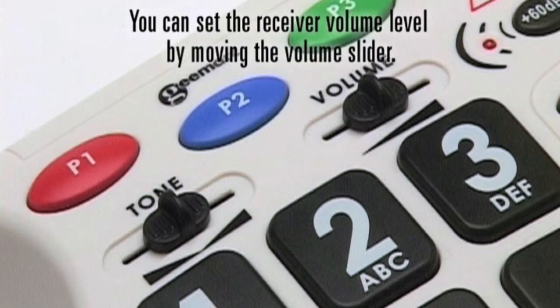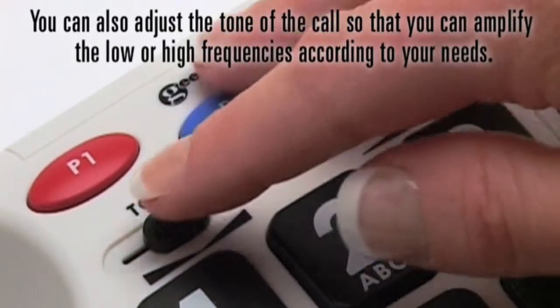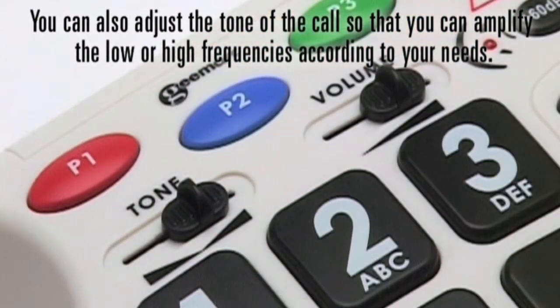You can set the receiver volume level by moving the volume slider. You can also adjust the tone of the call so that you can amplify the low or high frequencies according to your needs.